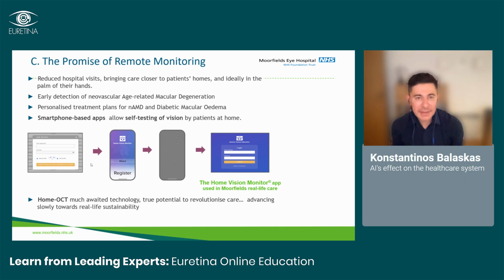And then moving a step further, there is the promise of remote monitoring. Anat has done some spectacular work on home OCT. I will talk a bit more about home vision monitoring. We used one of the FDA-approved and CE-marked home vision monitoring apps. It's a smartphone-based app, so it's a cheap technology. It can be available at scale. We performed the first deployment in real life at scale of this technology on more than 500 patients.